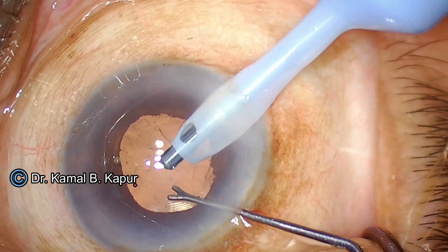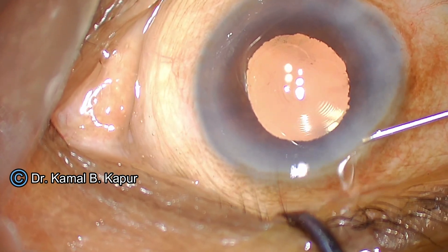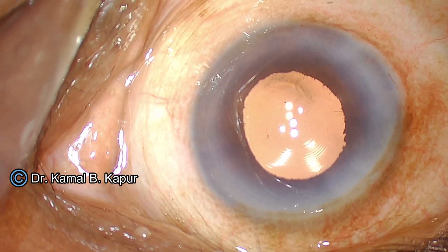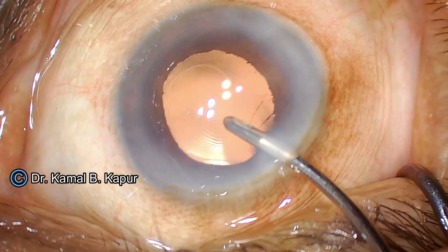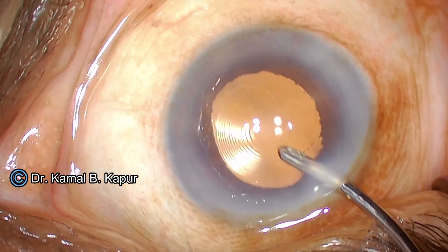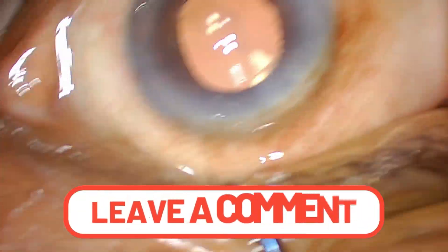You realize that the pupil is still not distorted — it is symmetrical. After wound hydration and removal of the B-hex pupil expander, I proceed to correct the astigmatism. Initially from the start, I positioned my main incision at the steeper axis, and directly opposite to my main incision I create an OCCI at the limbus. In my hands, this is sometimes able to take care of astigmatism up to 0.65 to 0.7 diopters. In this particular situation, I have taken care of the astigmatism, managed a mid-dilated pupil, inserted a CTR, and the surgery has gone perfectly.